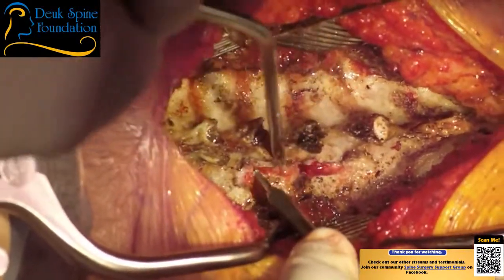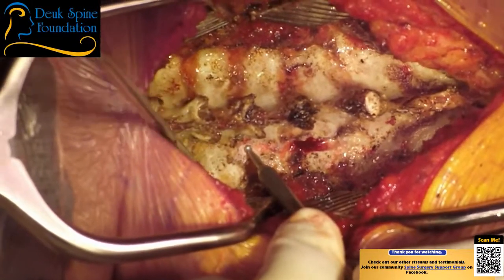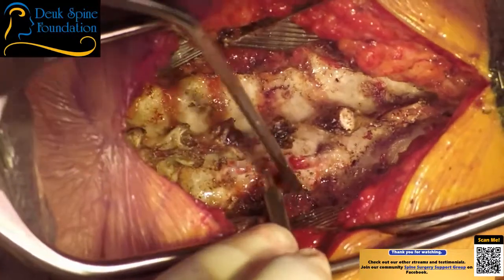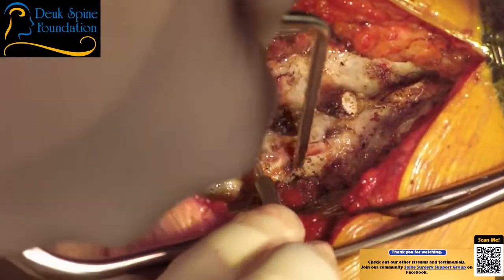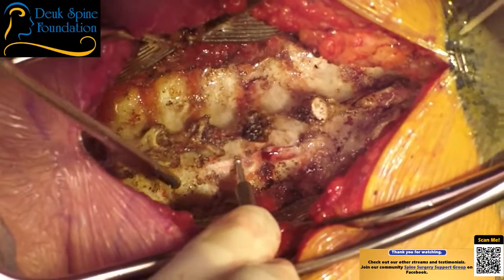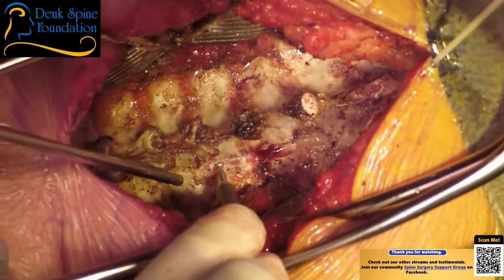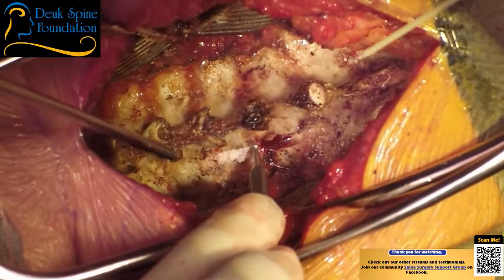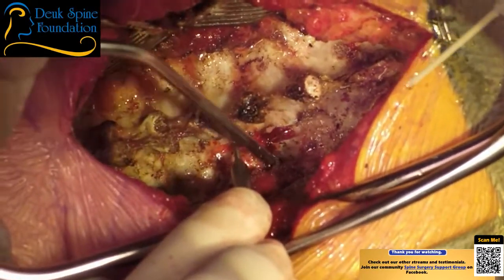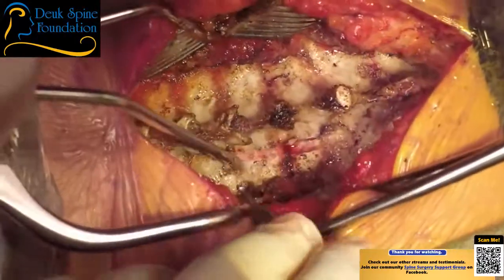So our goal is to remove this roof of the spine, called the laminectomy. That will take the pressure off the spinal cord in the back, and that will achieve one of our goals of decompression. The other is to unpinch the nerve roots in the neuroforamen. He has foraminal narrowing. All right, so that's 2 down.